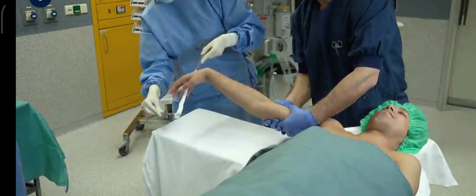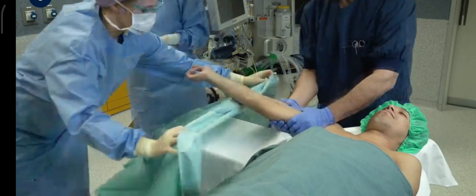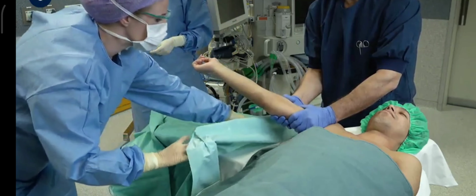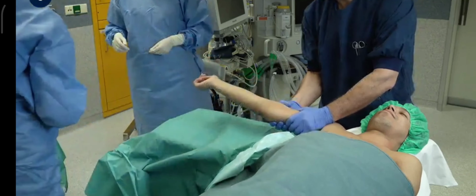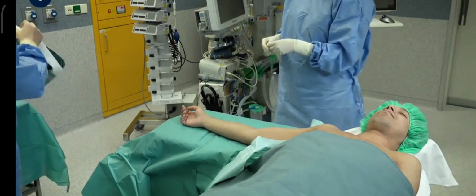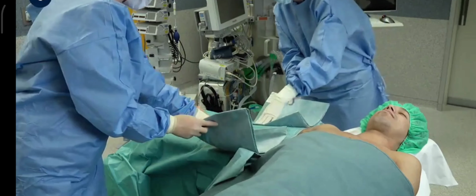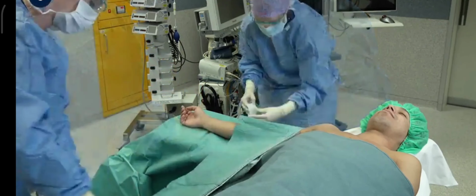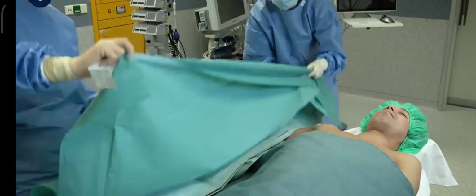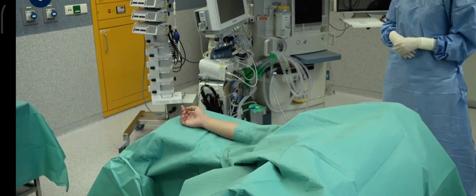With cleaning completed, the arm can now be draped. As previously demonstrated, first, a large drape is placed underneath the arm. Once the scrub nurse is clear, the assistant lowers the arm and makes room for draping to continue. Working in tandem, a large drape is positioned over the proximal arm. Once fixed to the patient, the sterile field is expanded and simple draping for the upper arm is complete.